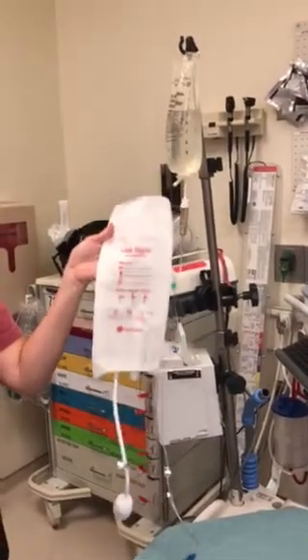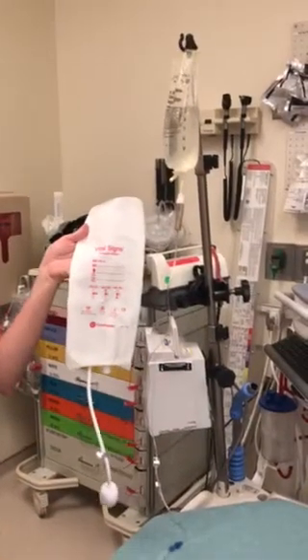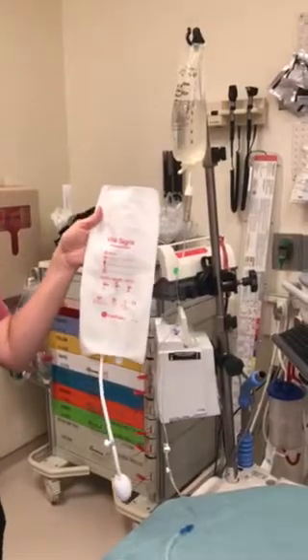We're going to talk about the pressure bag. Pressure bags can be found in the main Pyxis or in both code rooms — by the ortho equipment, in the drawer to the bottom left.